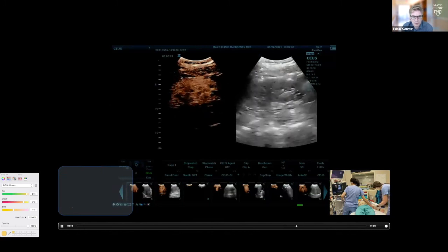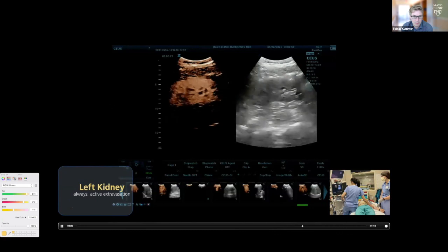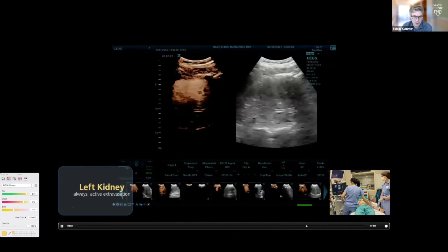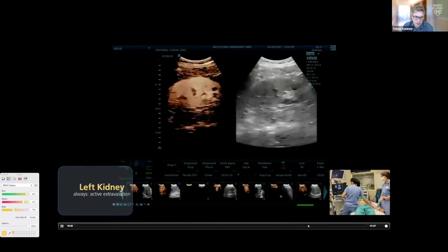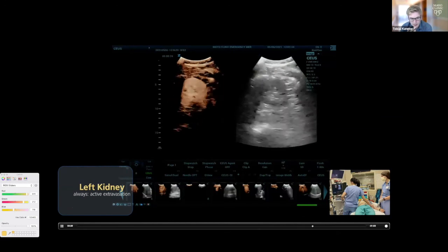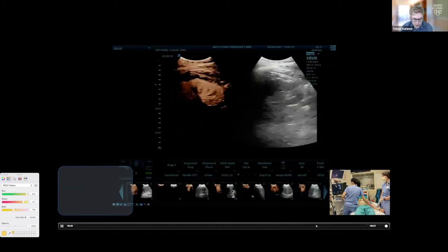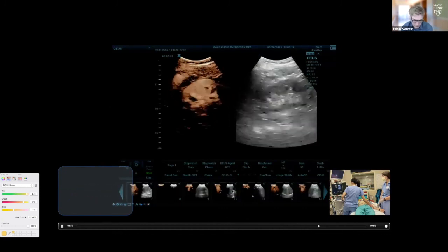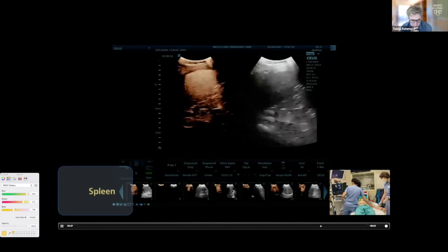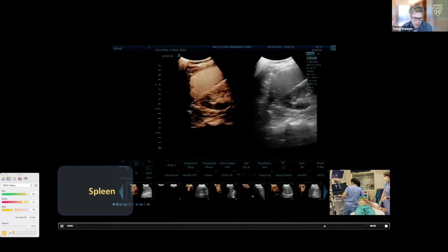So here you'll notice right now it starts to fade out with the contrast, and now you'll see it will significantly increase again. The brightness of the bubbles will come in again, and you can look again at any lacerations with that. And sometimes, as I said, especially in kids, when the kid is at a lower weight but is in a higher contrast group that gets a little bit more contrast, sometimes it's worth waiting a little bit until the contrast fades if you have too much contrast.